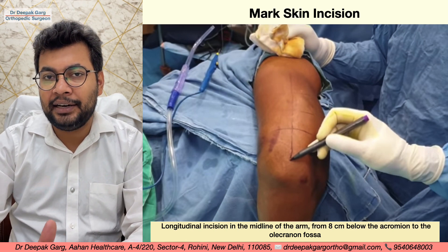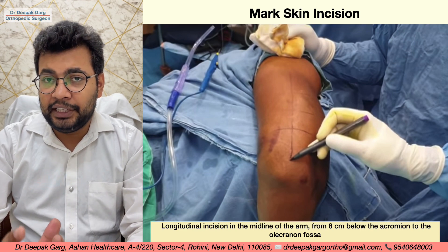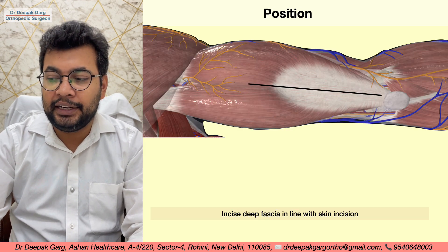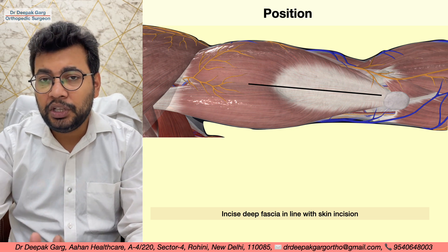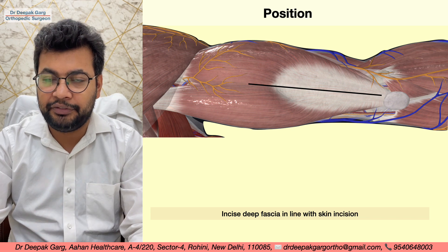We will take the skin incision and cut the subcutaneous tissue in line with the skin incision. We will then incise the deep fascia in line with the skin incision, exposing the triceps muscle.